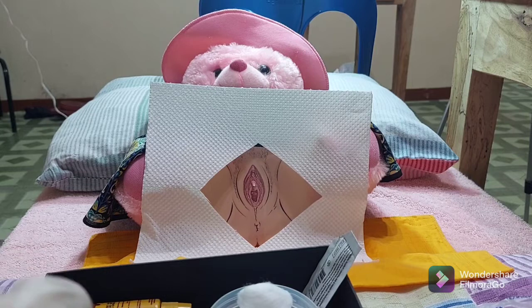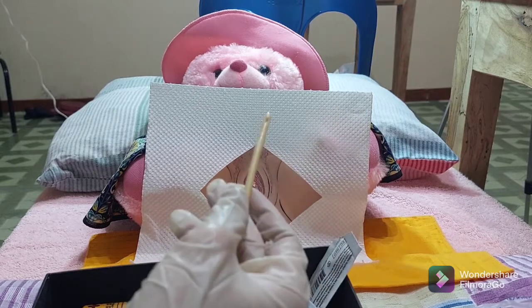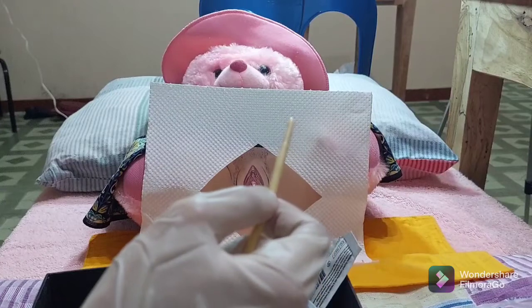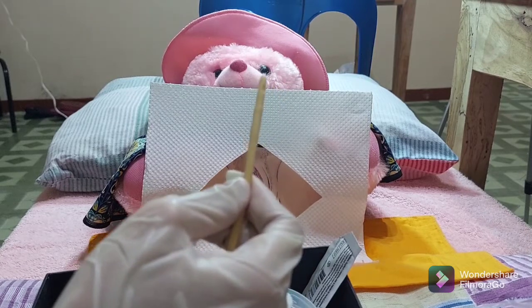Now pick up the catheter with the sterile dominant hand, 7.5 to 10 centimeters below the tip of the catheter. Holding the catheter closer to the tip will help to control and manipulate the catheter during insertion.